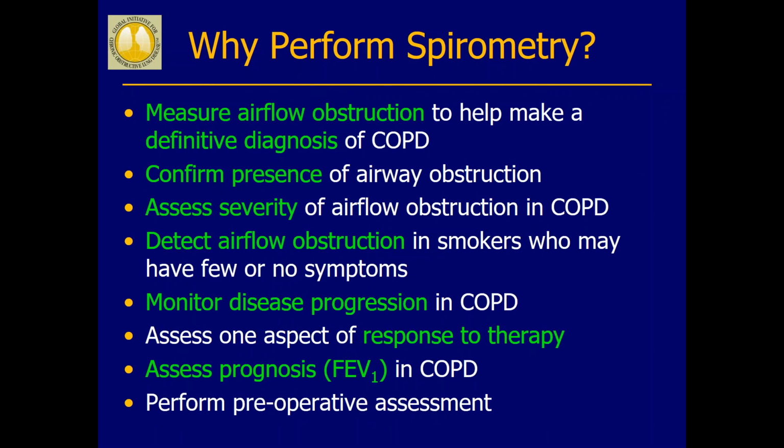And so people may ask, why do you perform the spirometry? It's good to know why you're doing it when you're doing the test for a patient, if someone else asked you to do the spirometry. One is to measure airflow obstruction to help make a definite diagnosis of COPD. Also, it's used in asthma and other lung diseases as well. Confirm the presence of airway obstruction. Assess the severity of airflow obstruction in COPD.